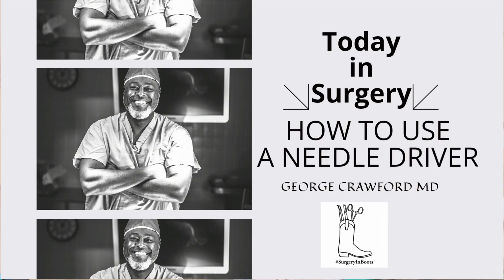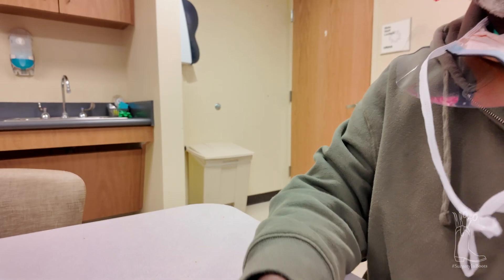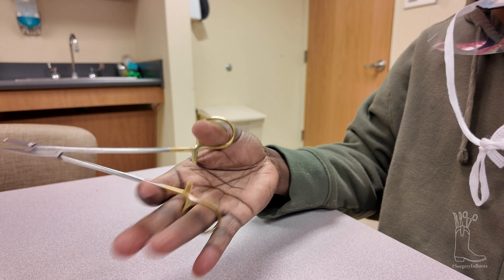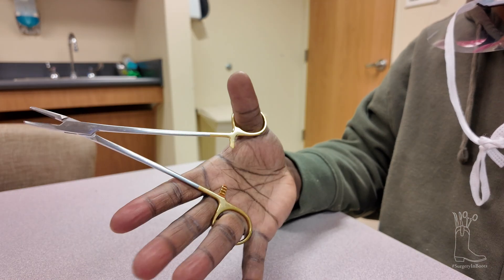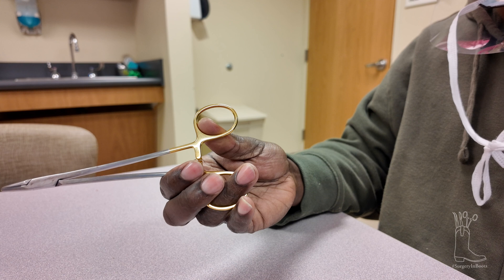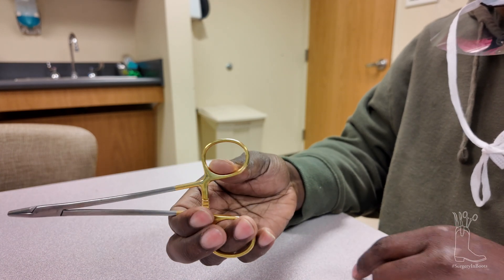All right, long day of surgery and this person here doesn't know how to palm a needle driver, so I'm going to show you how to do this. This is one of those things you just got to know how to do. Stop looking at me, look at the instrument. So when you palm a needle driver, most people think you're supposed to put it in here like this — that is not how you use it.